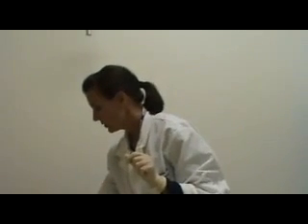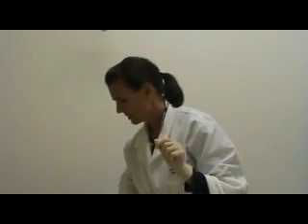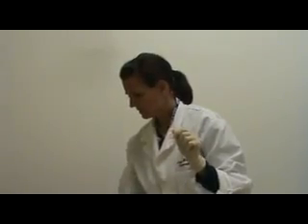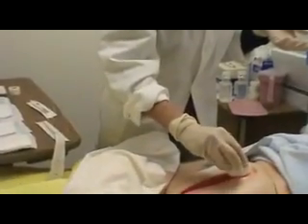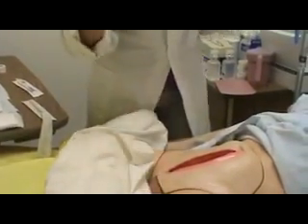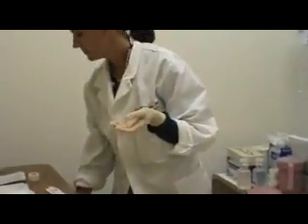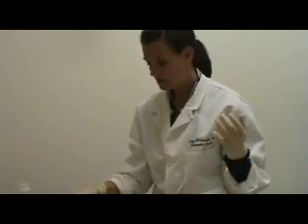Now I am going to clean the wound bed. So I am going to use my first package of 4x4s. Not so wet. And then I am going to wipe from the area of least contamination to most contamination. So I'm going to go from the belly button down with one swipe. And then I'm going to dispose of that. Now this is no longer sterile, so it's okay if I reach over that.